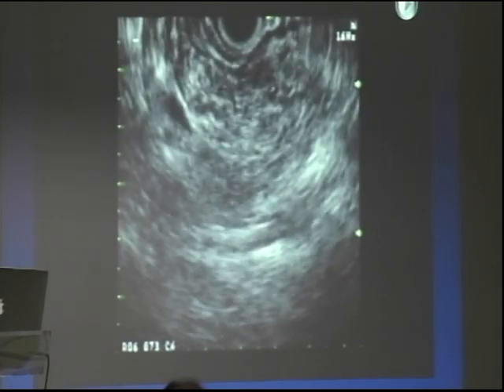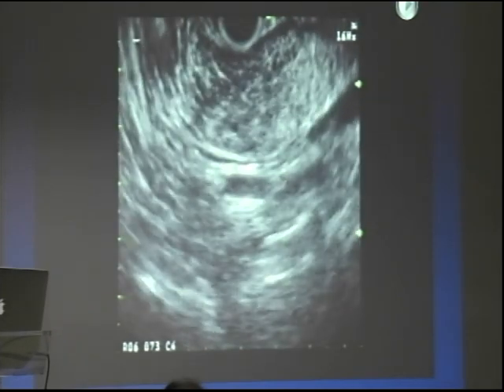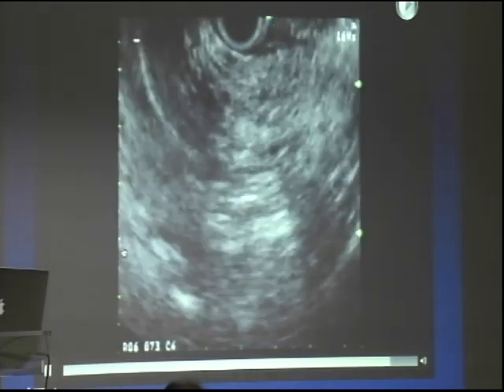Here, you can see we have slipped back, probably into the duodenal bulb, and if we have done an insufficient examination of the head of the pancreas, we should go back to the ampulla and re-examine this area.